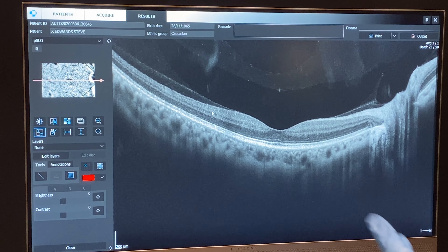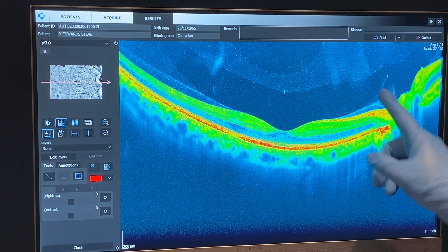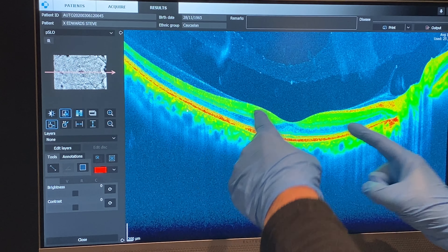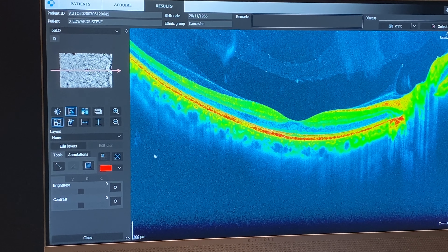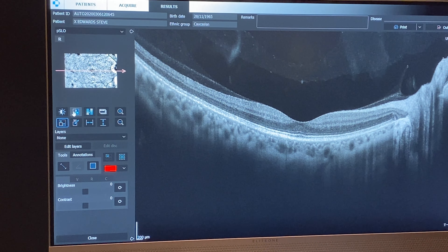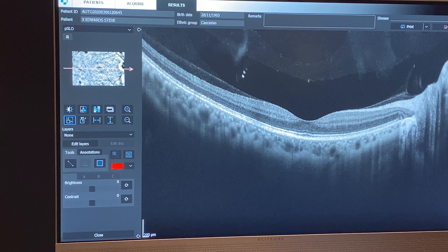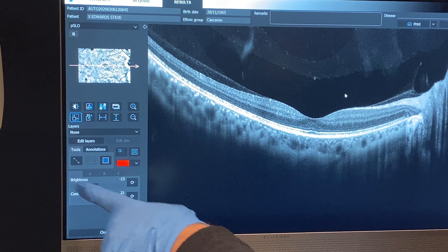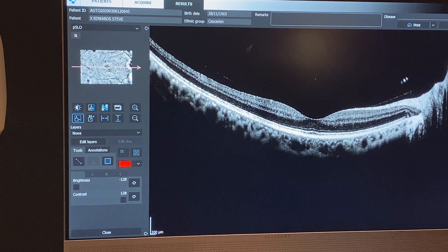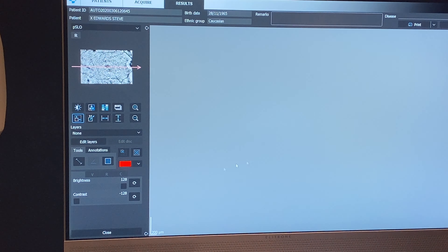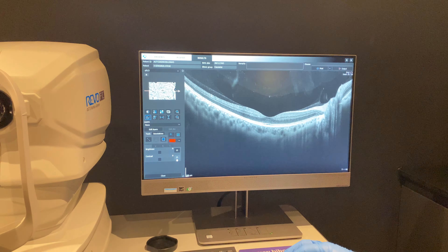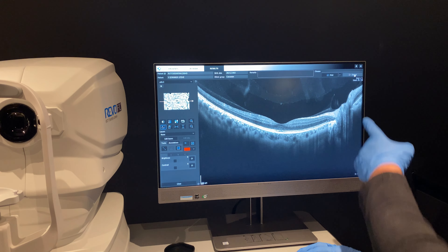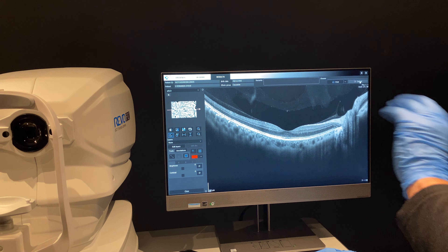This type of scan is one of very few where color is quite good to look at the detail in the vitreous. The vitreous is nicely attached either side of the fovea there. In black and white you can adjust — all I'm doing with the mouse is adjusting the contrast and brightness down here. I'll just reset it, and then we could output that and do that as a report.